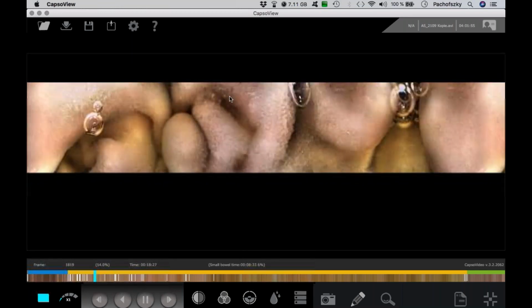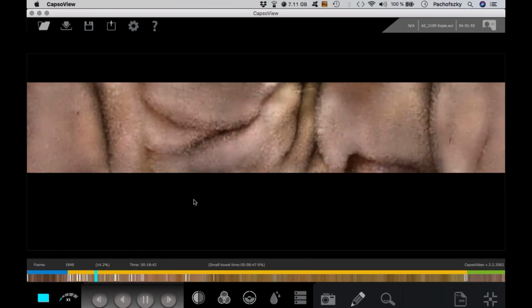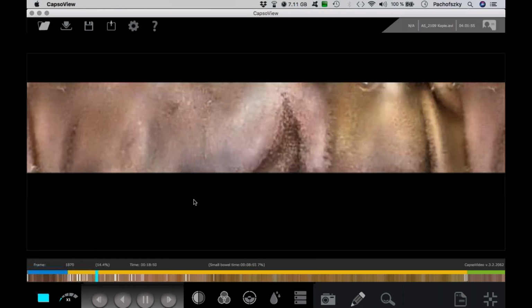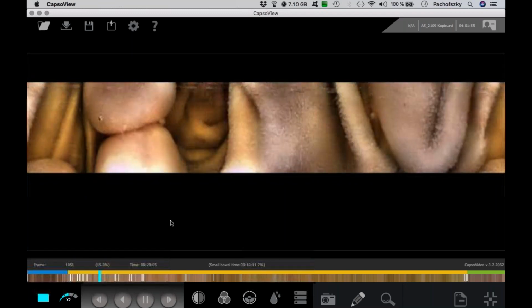Just look at the good quality of this video, even though I told you it's an older video. We have some interference here in this area. It's now solved with the new software and the CapsoCam Plus. Maybe we will go down a little bit faster, so I double the speed.